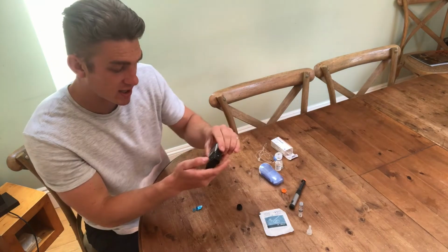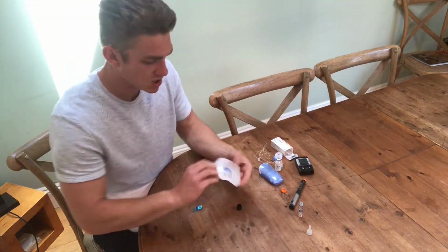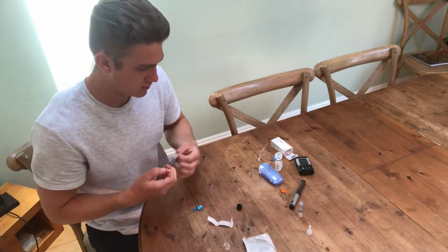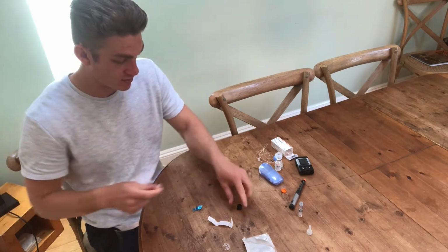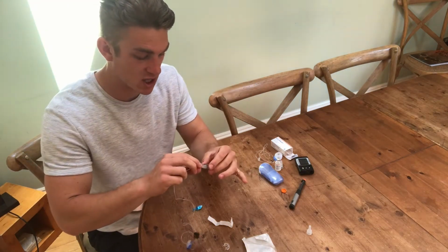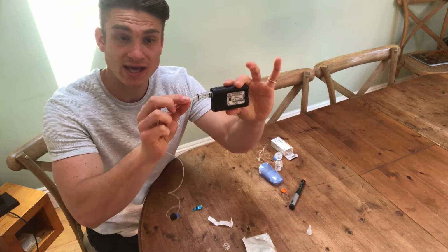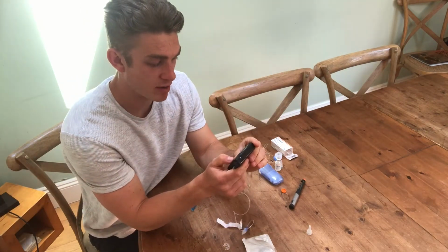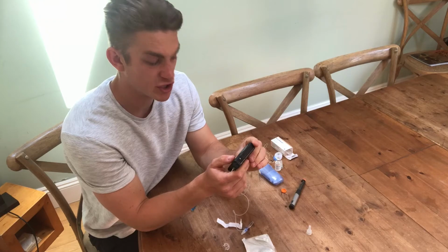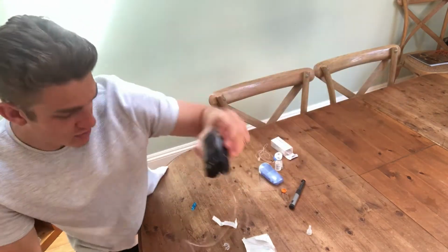The pump has just told me that it's ready, so it's got enough space in the hole to fit the cartridge. So I need to get my tube. Look, it's twisted, it's like headphones. The ready-made insulin cartridge that I've just done, twisting it on. I can then put this into the pump. I then ask the pump to load the cartridge. So it's loading the cartridge ready.